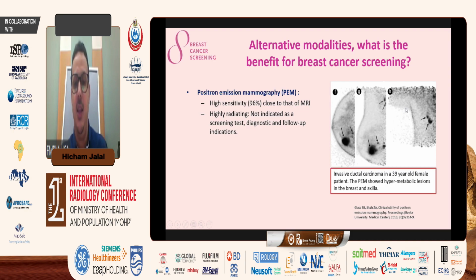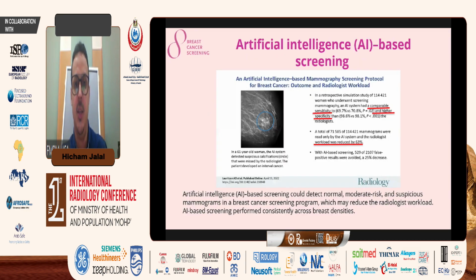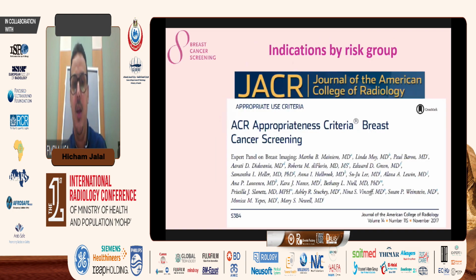Thank you so much. And now we're talking about positron emission mammography. It has no indication in the screening test. Then at last we will see which indication for which population.